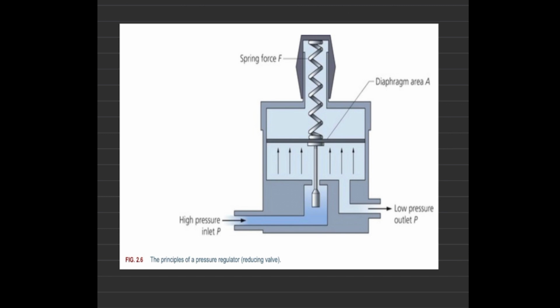This concept is used. Pressure is equal to force upon area, and keeping force constant, we have P1 A1 equal to P2 A2.